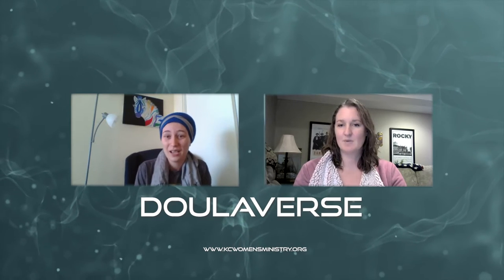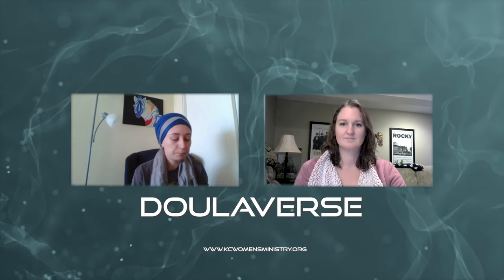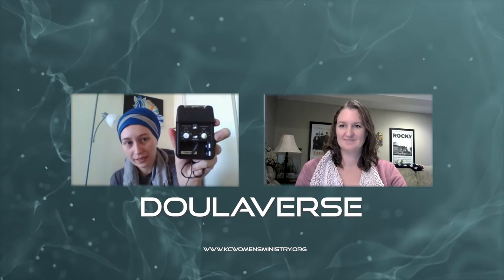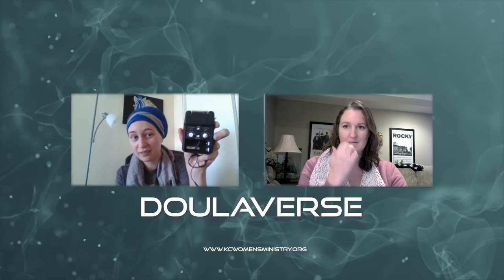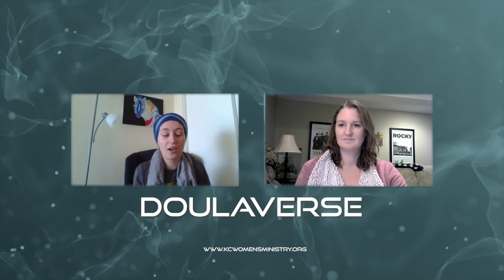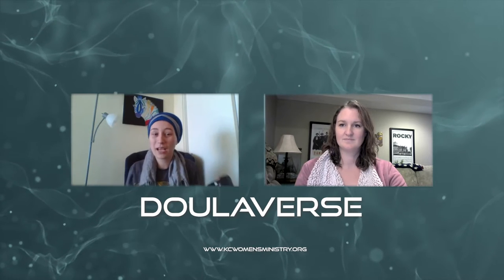Mine came super fancy with all these dials — I learned how to set the settings in class, but I never touch them anymore because I don't know the difference. You don't necessarily need the fancy ones with all the dials, because the ones without dials are already set properly. You're most likely not going to be changing the dials, especially if you're using it for labor or any kind of pain relief. It is FDA approved for pregnant women to use during labor.